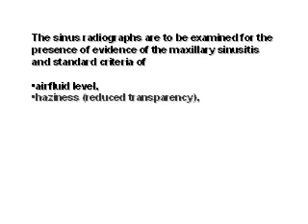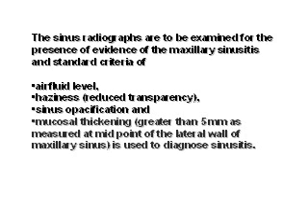The sinus radiographs have to be examined for the presence of evidence of maxillary sinus disease and the standard criteria of air fluid level, haziness, sinus opacification, and mucosal thickening, which is greater than 5 mm as measured at midpoint of the lateral wall of the maxillary antrum. This is used to diagnose sinusitis.